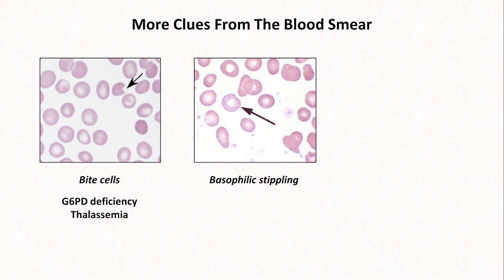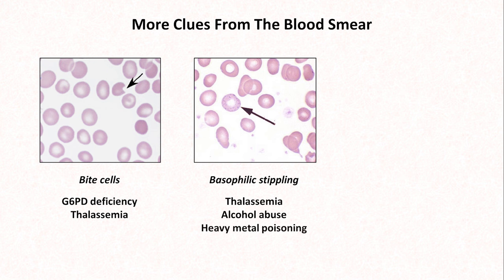Basophilic stippling — the bluish-purple speckles within the cytoplasm of an erythrocyte — represents ribosome precipitates. This can be seen in thalassemia, alcohol abuse, and heavy metal poisoning.